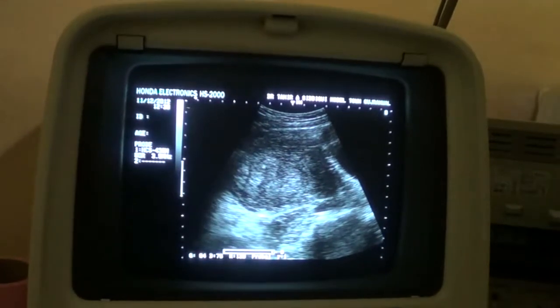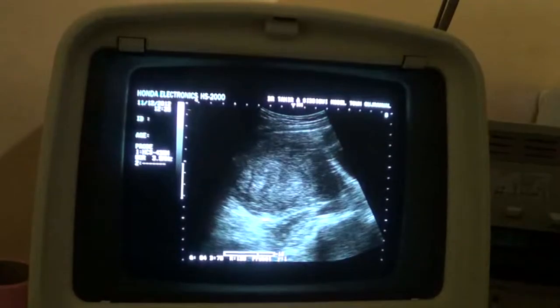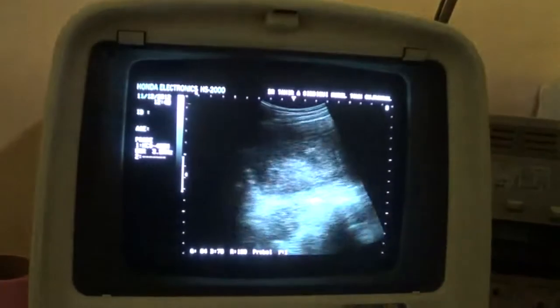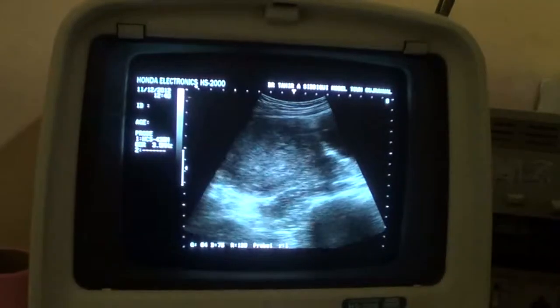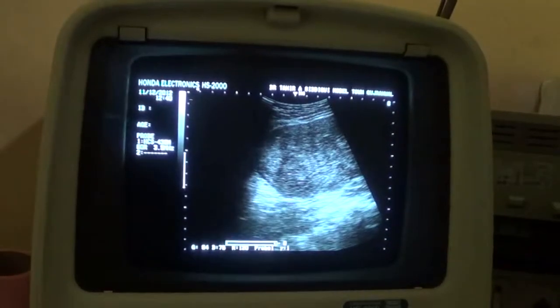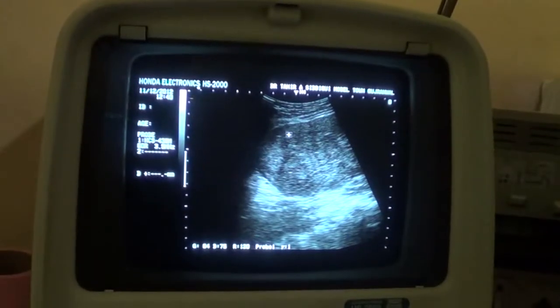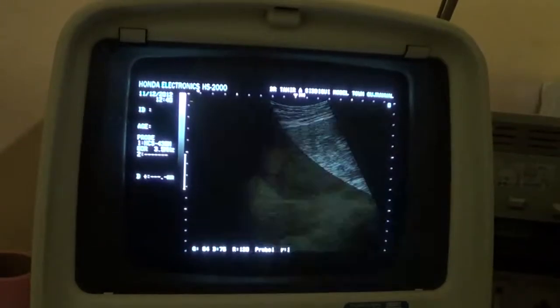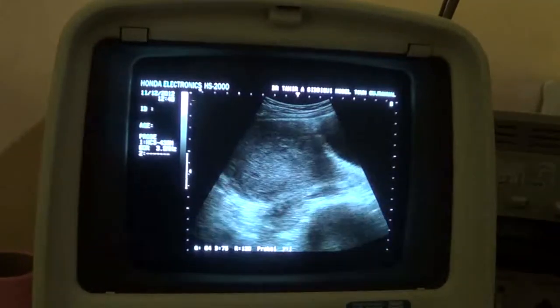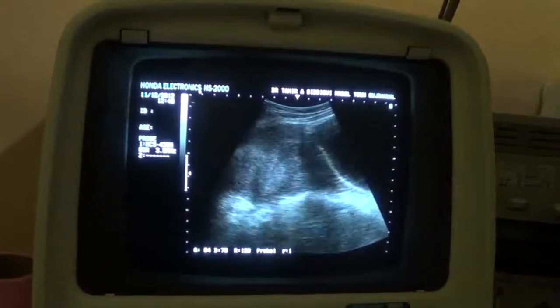as is the endometrial canal, and this is the cause of her primary infertility, that is a fibroid in the posterior uterine wall extending into the fundus region. This is the fundal region, this area. This is the anterior myometrium. Now this fibroid is elevating the uterus upwards.